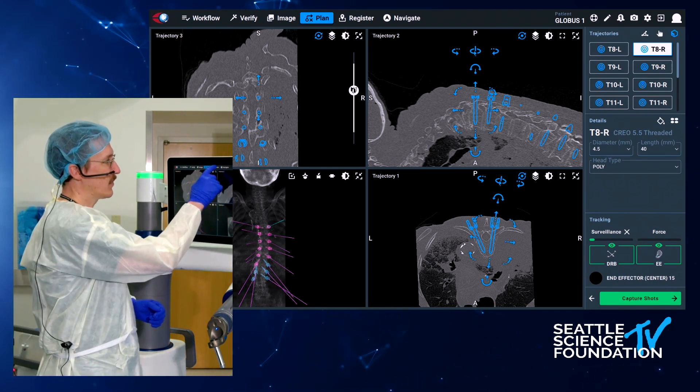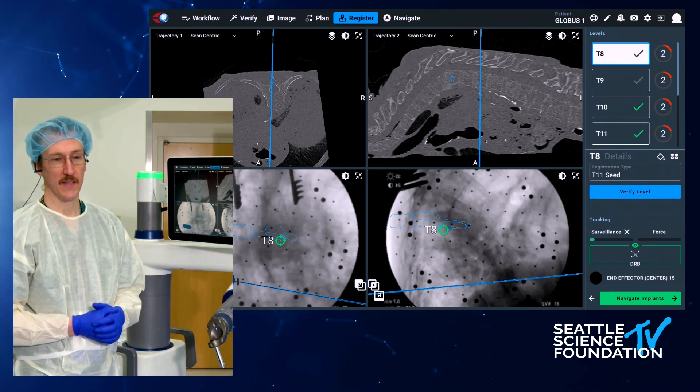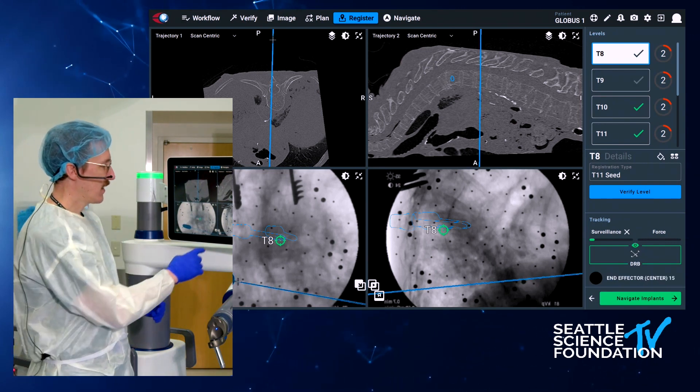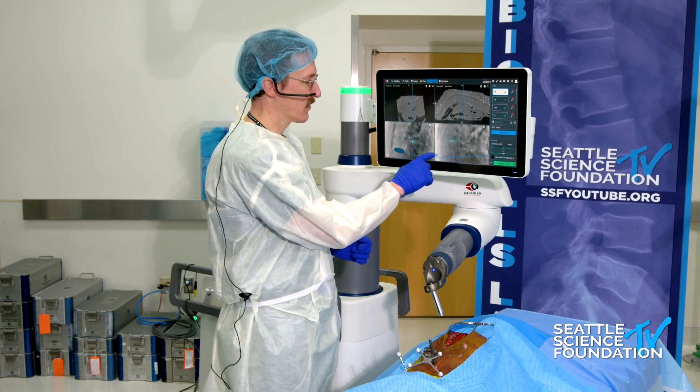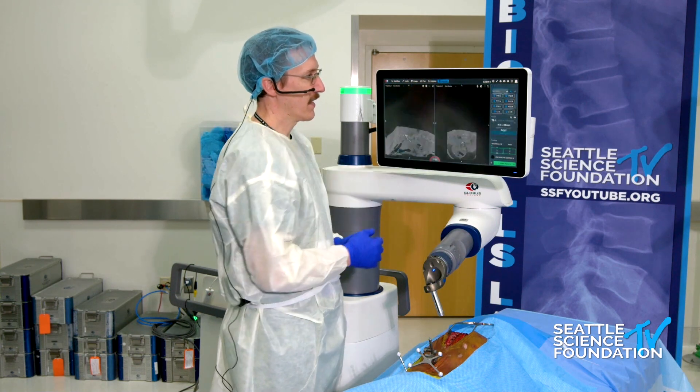Once we've planned it, we go through a registration process. For sake of the demonstration, we did that before we got on camera, but it involves an AP and a lateral shot, which is then merged together in a way that you can verify yourself as the surgeon and verify the level. And then ultimately we go on to navigation.